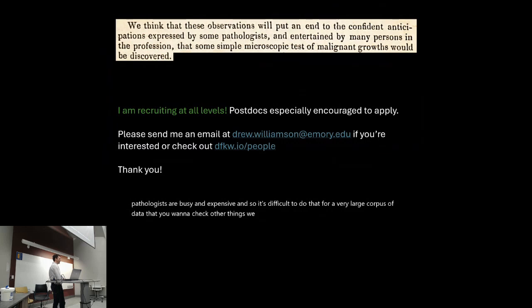Other things we did was have multiple choice questions that the model would have to answer and say, given a couple different options, which diagnosis is closest to this image or caption, that sort of thing. And then another thing you can do is just extract the features and then use the natural language features for downstream tasks.